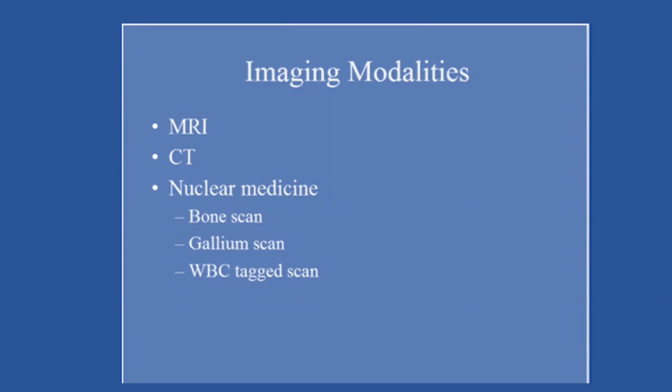Now, I'll tell you, I do spine surgery. And let me tell you, one of our difficulties, in spite of using titanium, where they claim that MRI you can do, we're having a lot of interference. And there are means in which we can remove the interference to some degree, but it decreases the resolution.